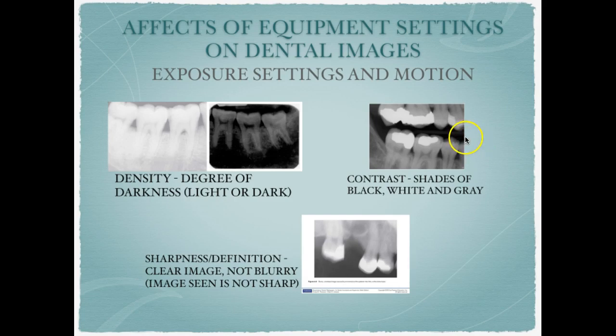And this is really a preference of the doctor in viewing their radiographic images. What's nice about digital X-ray systems is that your contrast can be adjusted after the exposure through your dental image software.